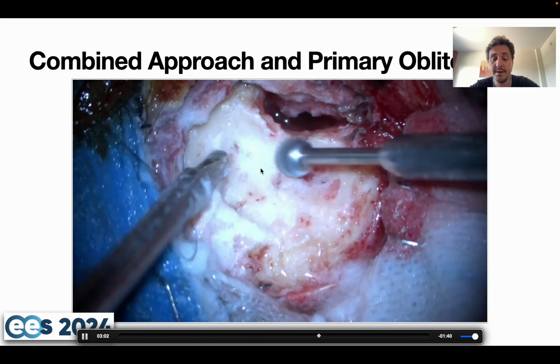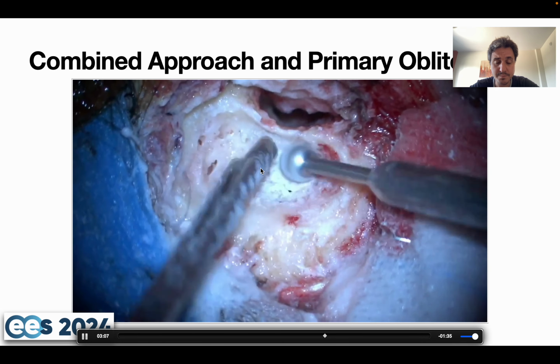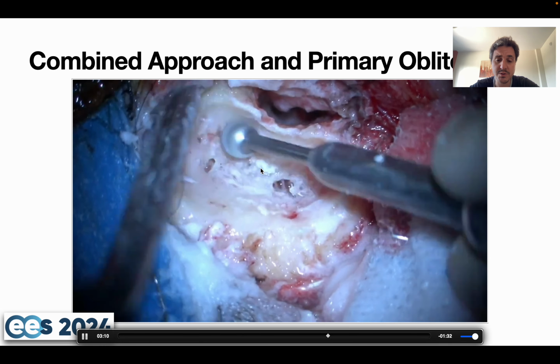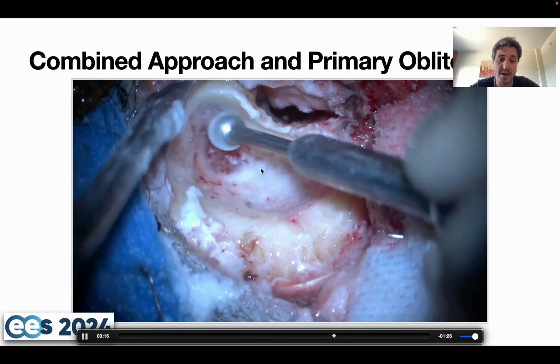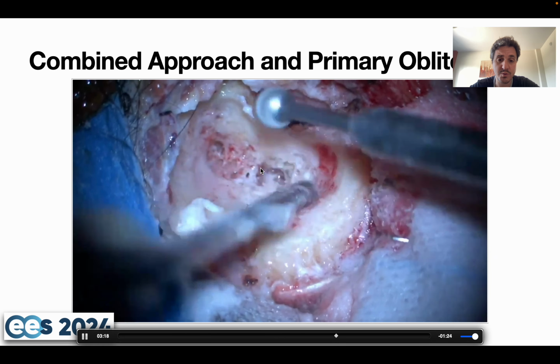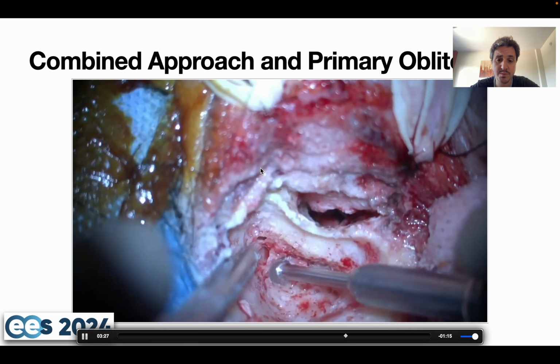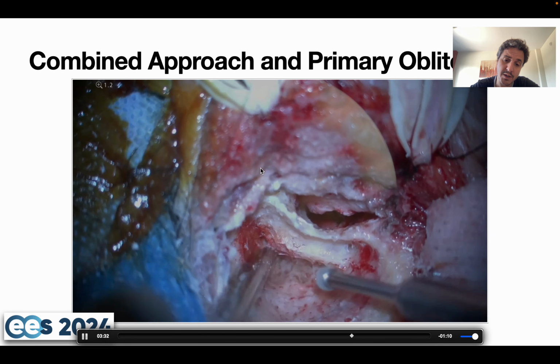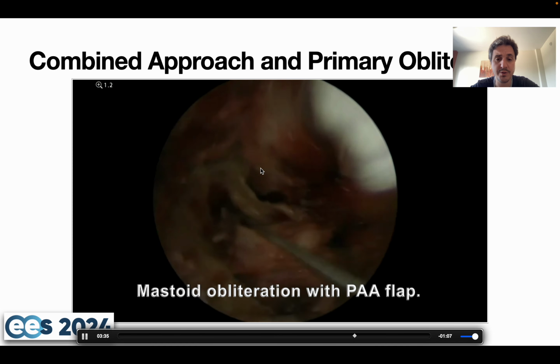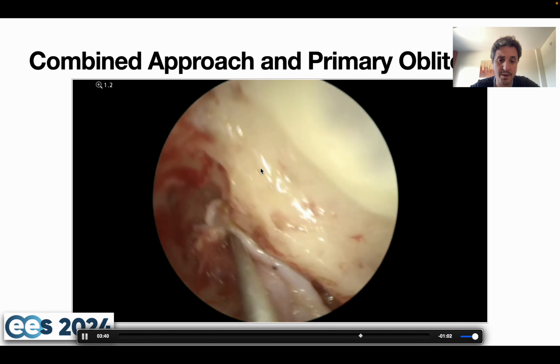The well-aerated mastoid shows us that probably there will be no cholesteatoma in here. So that's why we're going to use it just to put our flap inside and reconstruct and do our scutumplasty in this manner. So as you see here, there's no mystery about the canal wall-up mastoidectomy. We're going to enter the antrum, and once we have a very wide exposed antrum, it is what we call an open corridor, the mastoid corridor that we call for entering to work with the endoscope.